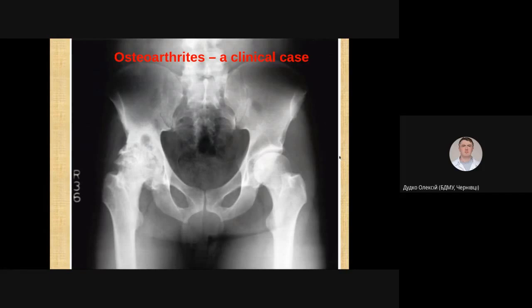Let's take as an example a hip joint. We can see left and right hip joints with different stages of osteoarthritis. Let's start from the right side.